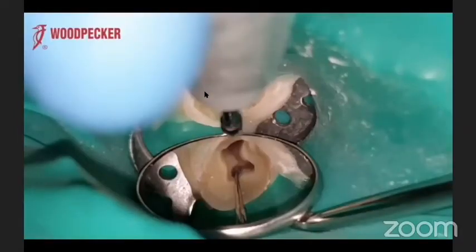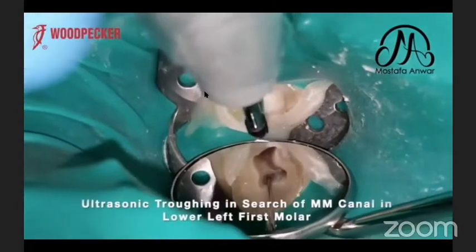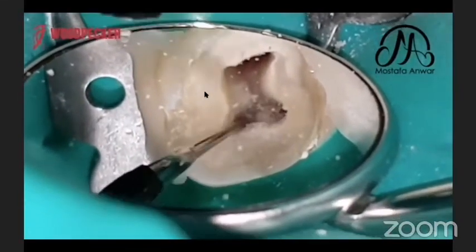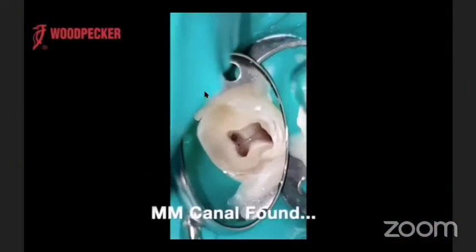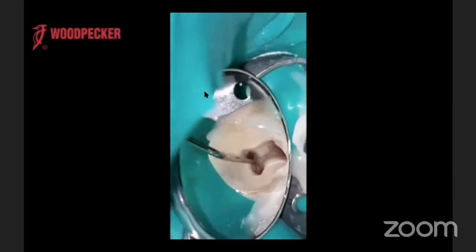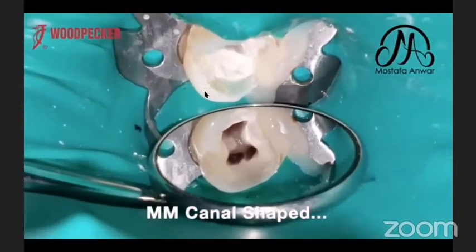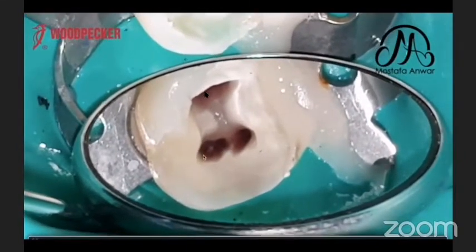In this video, I was looking for the middle mesial canal, so I started troughing between the mesial buccal and mesial lingual. I removed the isthmus between the two mesials and found the orifice of the middle mesial canal. I confirmed it with my probe, then proceeded with shaping and filling. The middle mesial canal joined with the mesial buccal canal.